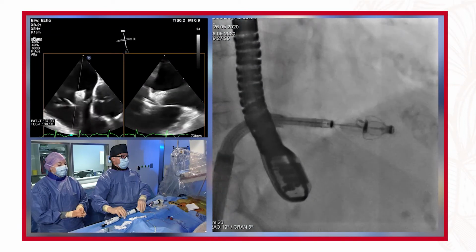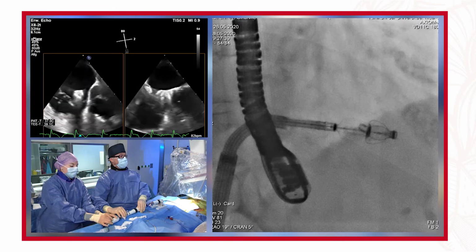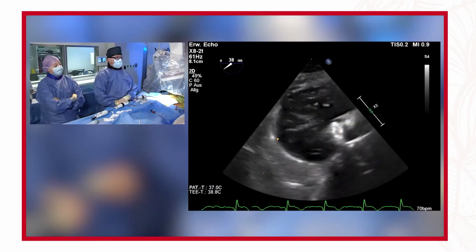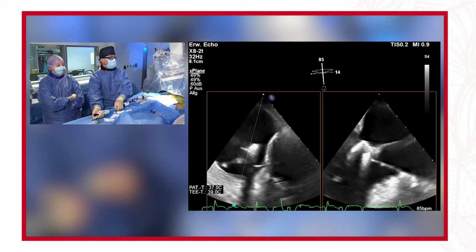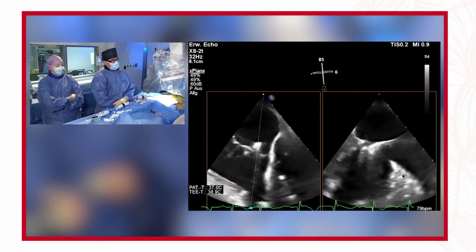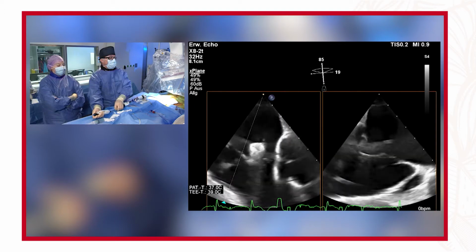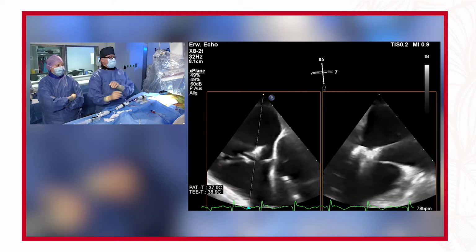Now we're doing this so-called Tarzan maneuver, that we're swinging over to the septal leaflet and trying to catch the septal leaflet again. You see that the septal clasp has been pulled down. Again, this is quiet. We are looking, before we go to close the system, that we have a good leaflet insertion, and then the system has been closed. You see the nice going in of the anterior leaflet into the device, confirming the leaflet insertion in the transgastric view, and then closing of the system. You see the leaflet insertion in the anterior leaflet.